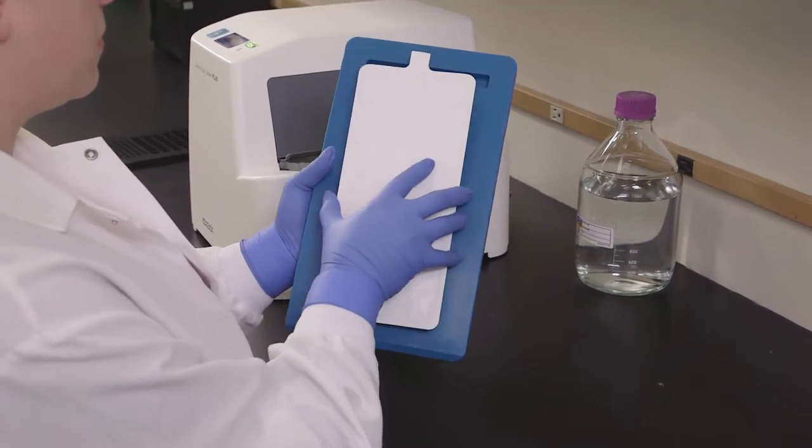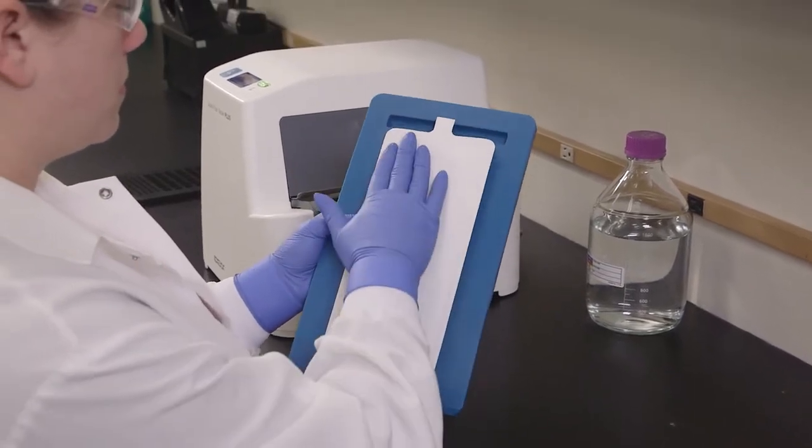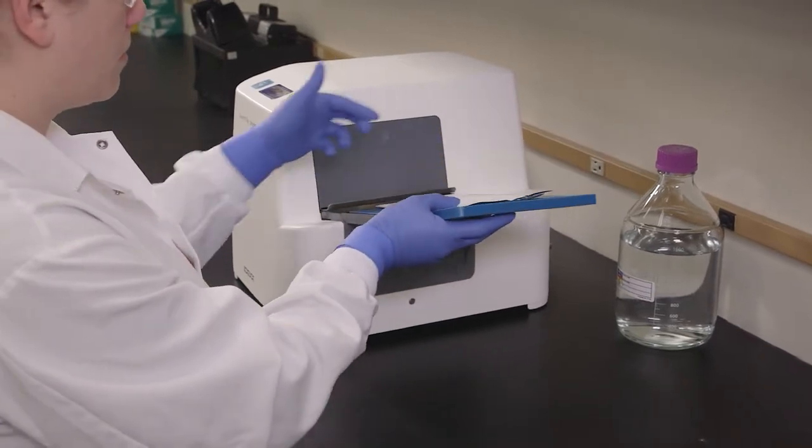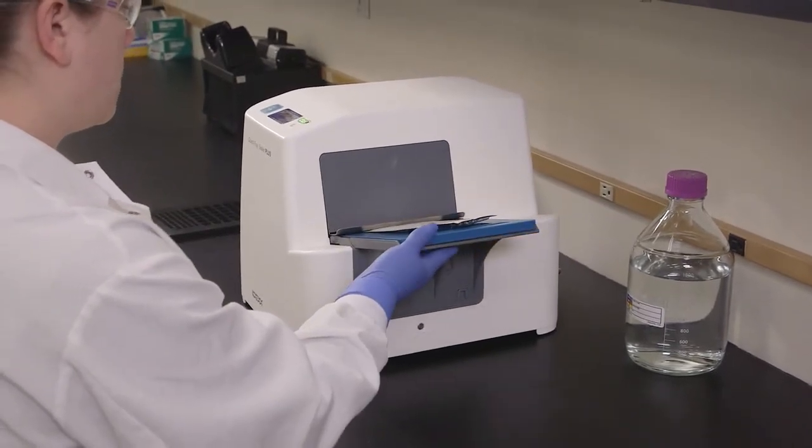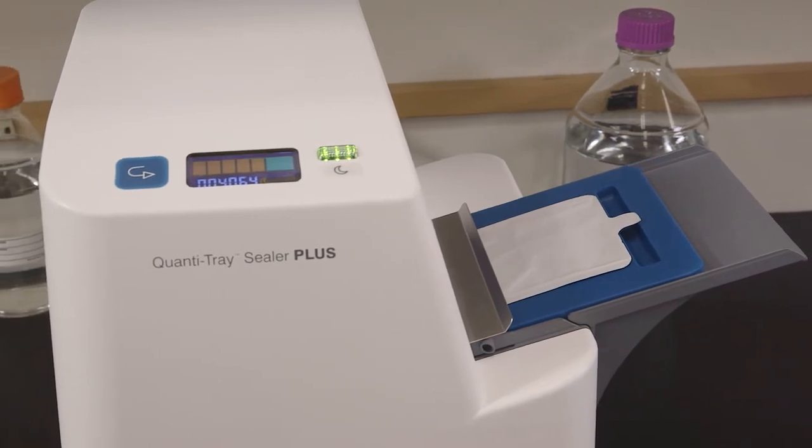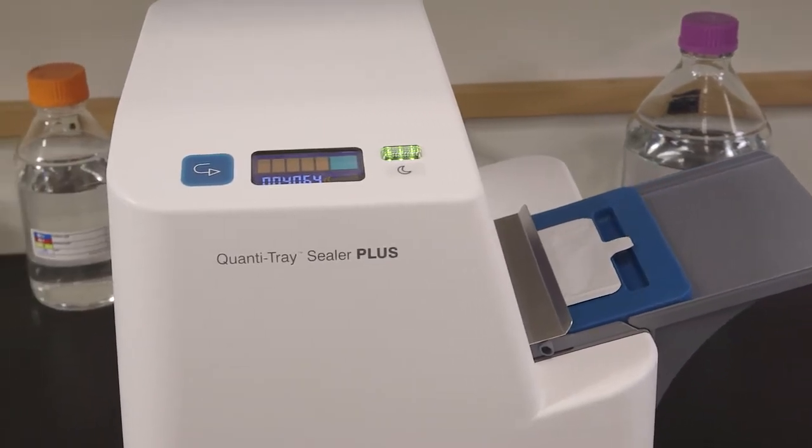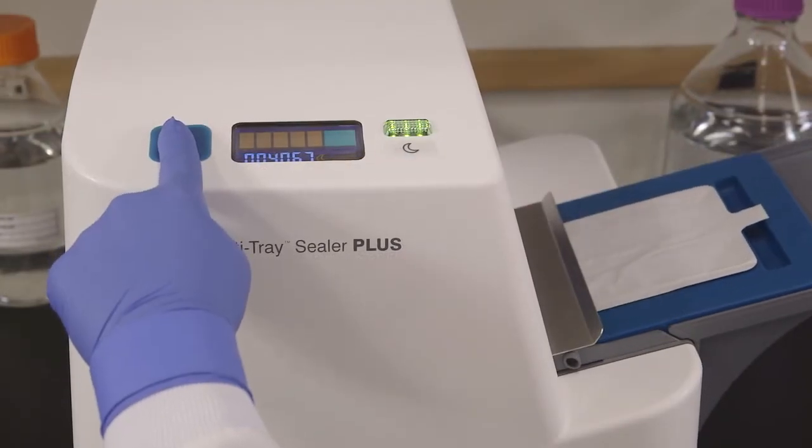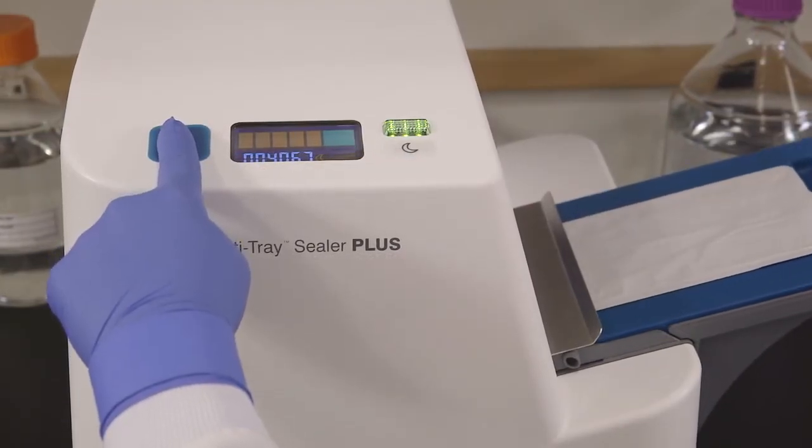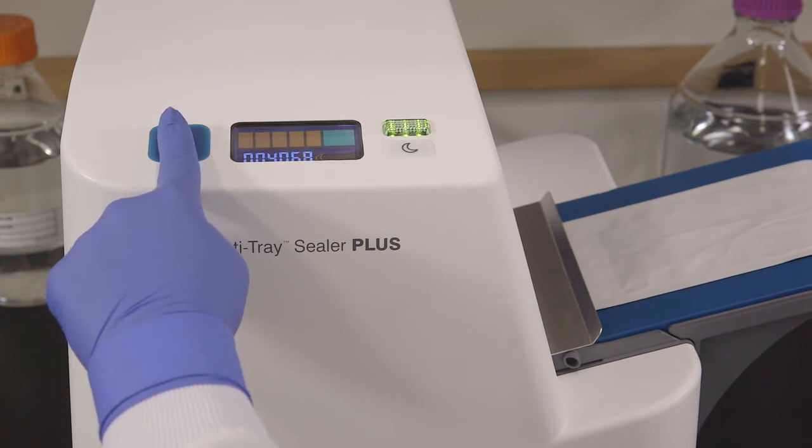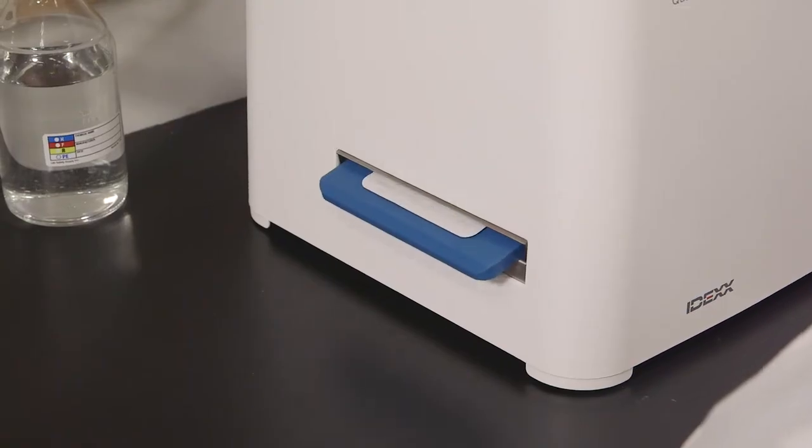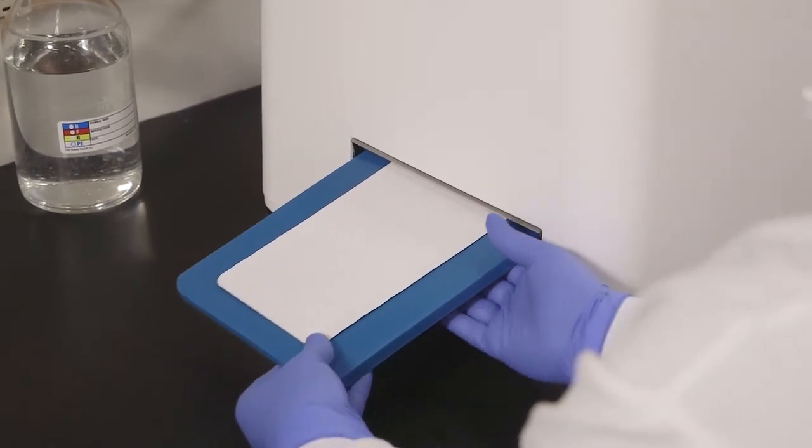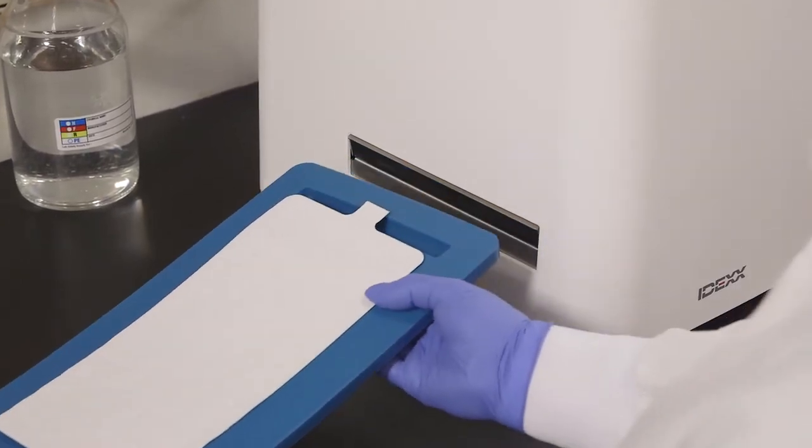Place the filled QuantaTray on the rubber insert, making sure each well fits its corresponding hole. Push the insert with tray into the sealer until the sealer grabs the tray and pulls it into the slot. If you need to reverse the motor, press and hold the reverse button. However, do not reverse the motor if the rubber insert is completely inside the sealer. The sealer distributes the sample mixture into the QuantaTray wells, seals the wells, and partially ejects the sealed tray. Remove the rubber insert and tray from the sealer.